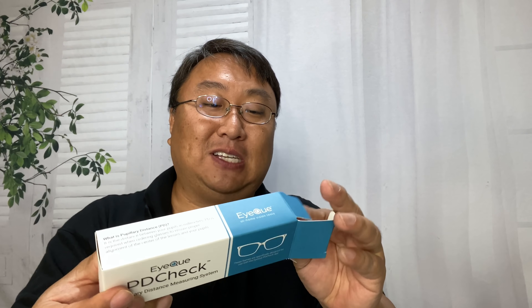...they want to make sure the prescription area is right on top of your eye. So to do that, you're going to need to provide the pupillary distance for your eyes. Enter this little box here — the pupillary distance check pair of glasses. I was excited to see these because I've ordered glasses online before and it's actually really difficult to get pupillary distance.